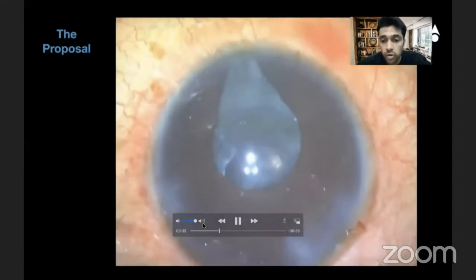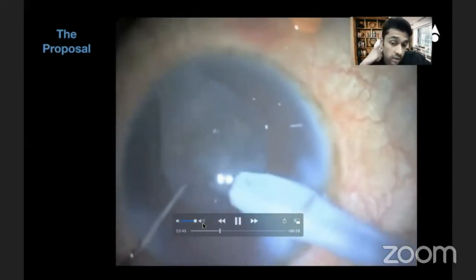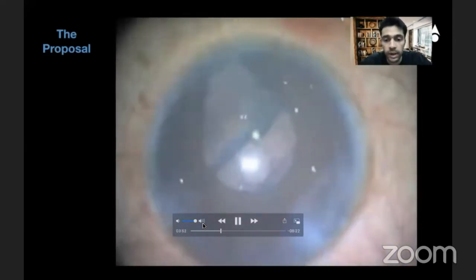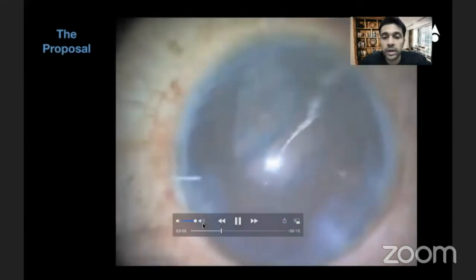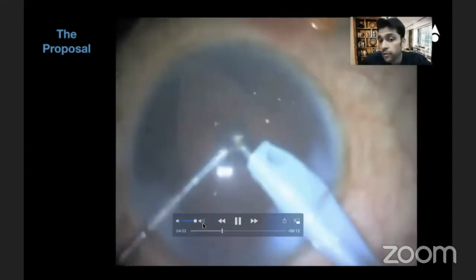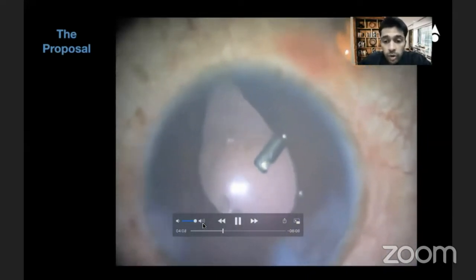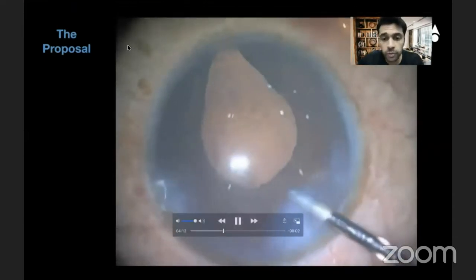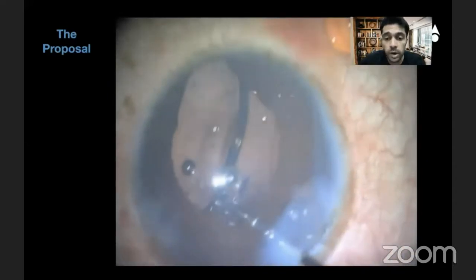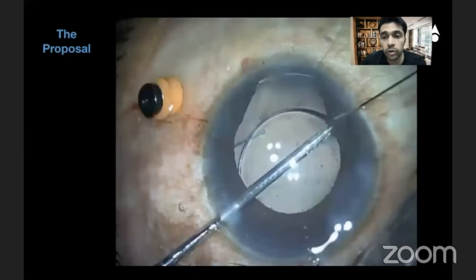Please make sure not to vitrectomize too much — seven to eight seconds does enough vitrectomy to give you the space you need. You can intermittently do it as and when required; each time you do it the seconds should reduce. Watch — I can keep doing this intermittently until I am through with all nucleus, epinucleus, and cortical removal. Even if this issue arises during IOL injection, I do the vitrectomy just before the intraocular lens is placed so that I have a good deep chamber at that point.